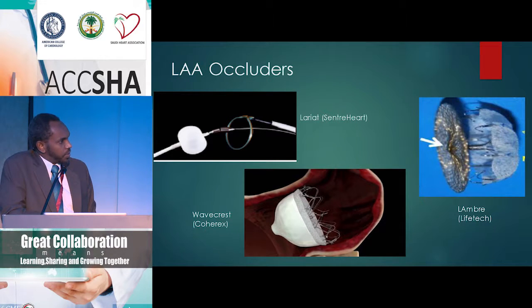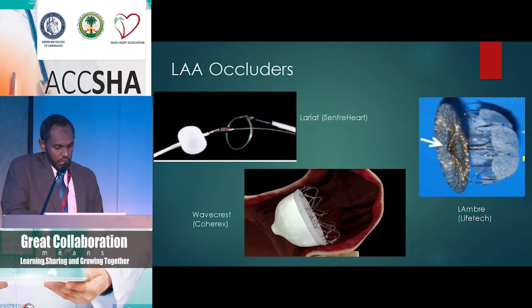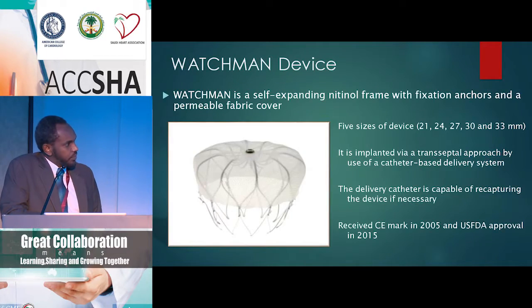Another couple of examples of endovascular devices are the Lambre and the Wavecrest, and these really haven't quite made it to the market yet, with ongoing studies and evaluations.